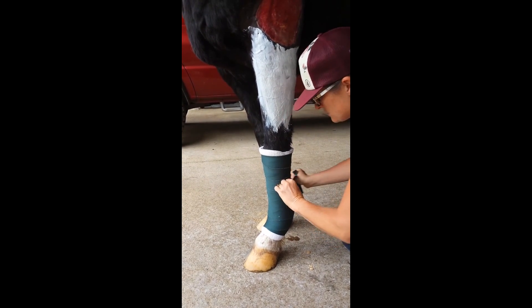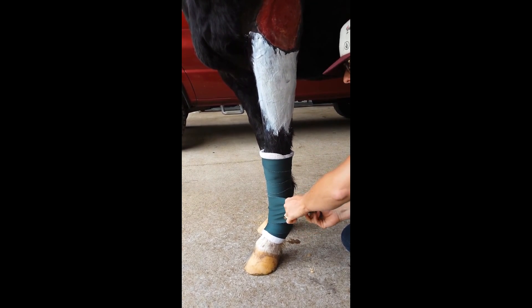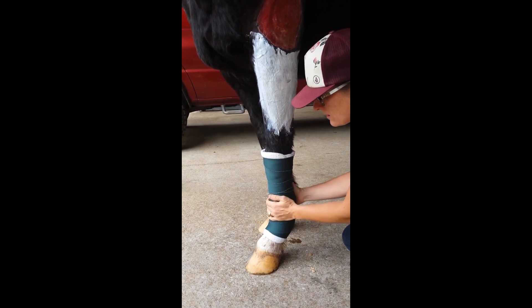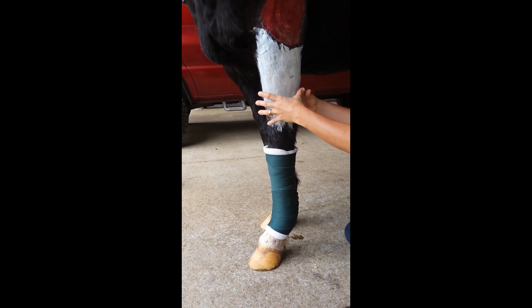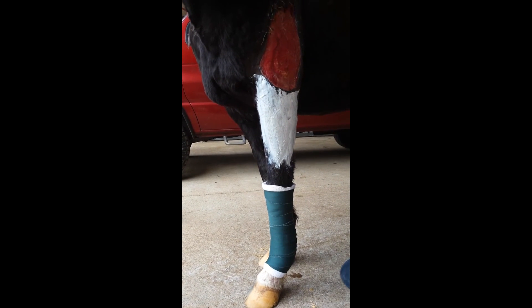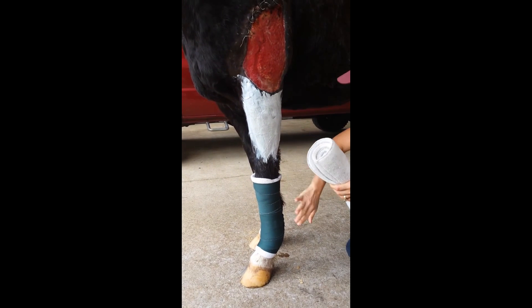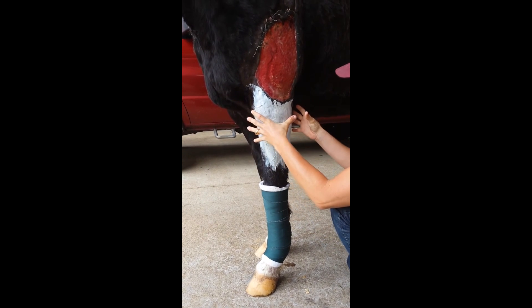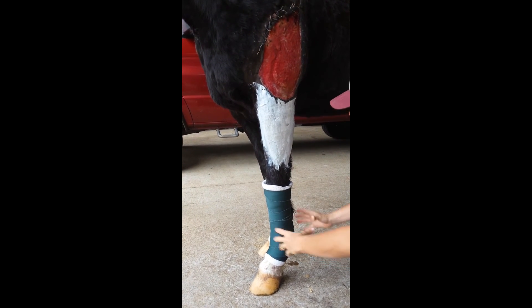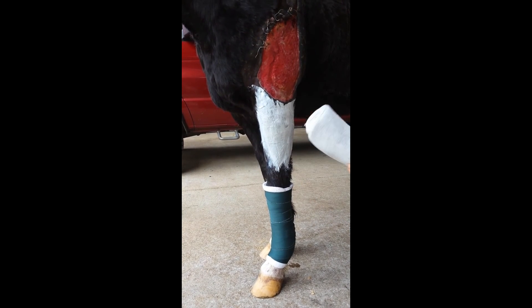By the time we've finished this bandage, the combination of the cotton wrap and the nylon track wrap is called a standing wrap, because we use these wraps on horses that are standing around and tend to get swelling in the lower leg. For this mare, I'm going to do a stacked standing wrap, meaning I'm going to wrap another bandage on top of this one to protect the area and absorb any of the exudate coming off the wound. With a stacked wrap, you have to wrap the lower leg first, because the leg tapers and if you put the top wrap on first it would start sliding down. So I wrap the bottom of the leg first to make it almost the same diameter as the top part of the leg.